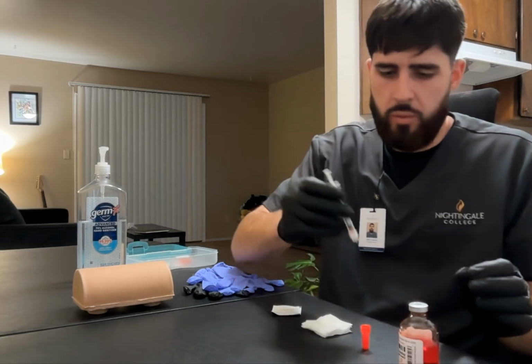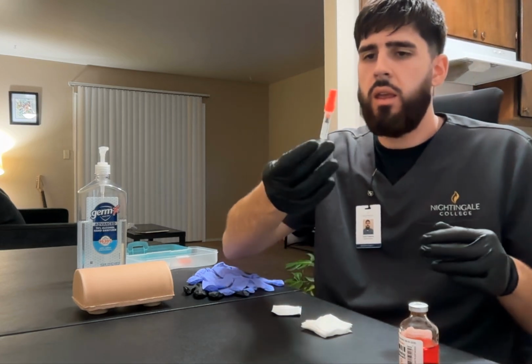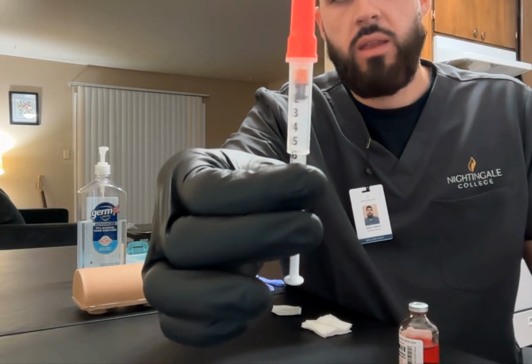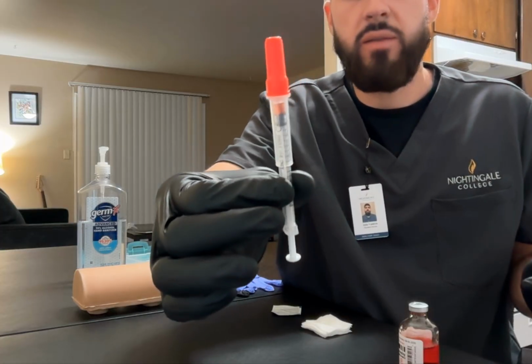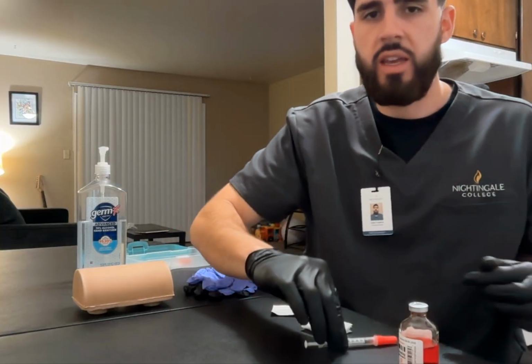Okay, I'm going to recap my syringe with one hand. Okay, that is 0.1 ml of medication in my syringe. That again is my tuberculin syringe, 1.0 ml, 25 gauge, 5-8 inch syringe and needle. I'm going to set that down.